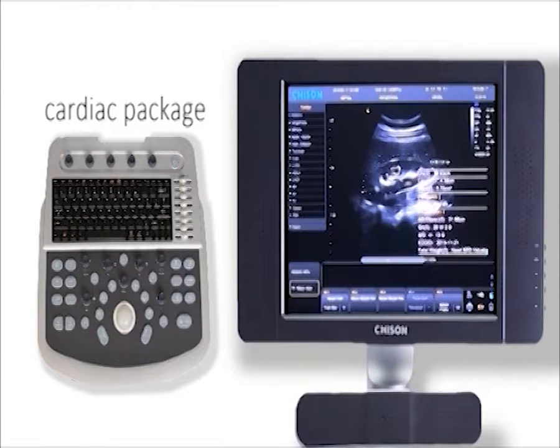Let's go to cardiac package. It offers you complete and professional methods in cardiovascular field: single plane ellipse, biplane ellipse, modified Simpson, bullet, cube. Choose any one as you want. It will show you professional clinical diagnostic results like EDV, ESV, SV, etc.